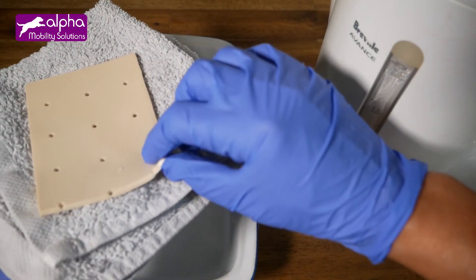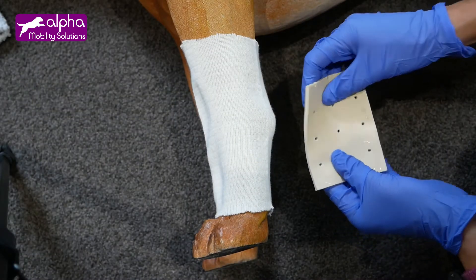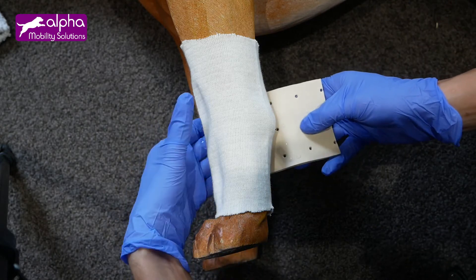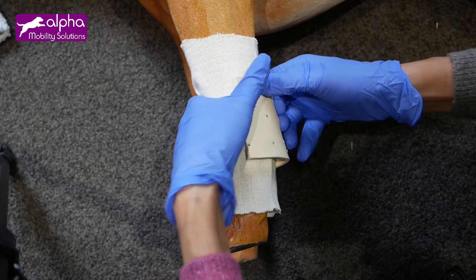Hurry, as you only have a few minutes to apply it to the patient before it starts to harden again. Place the soft sheet around the wrist, in the area where the dog needs support.